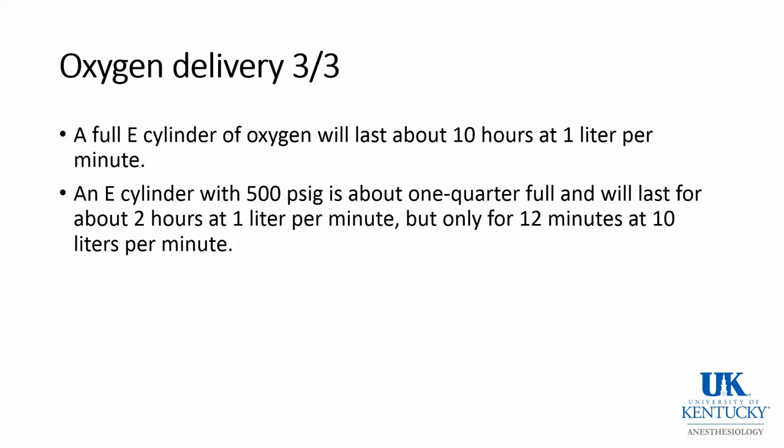A full E-cylinder of oxygen will last about 10 hours at 1 liter per minute. An E-cylinder with only 500 pounds per square inch pressure is about 1/4 full and will last for about 2 hours at 1 liter per minute, but only for 12 minutes at 10 liters per minute.